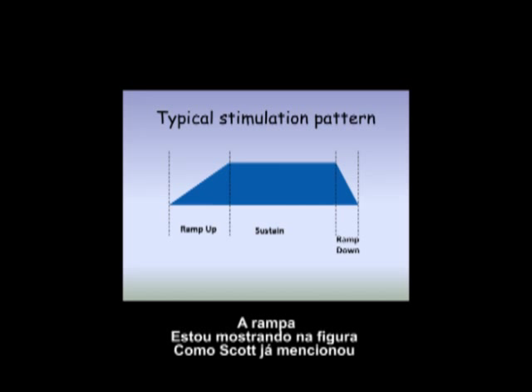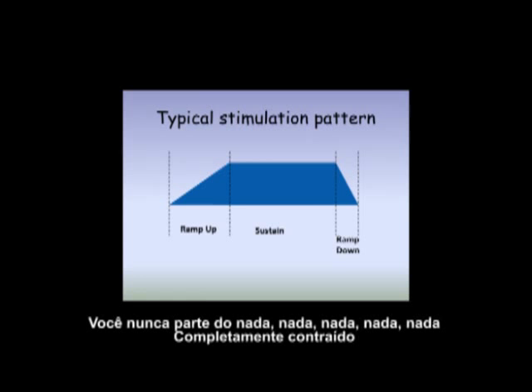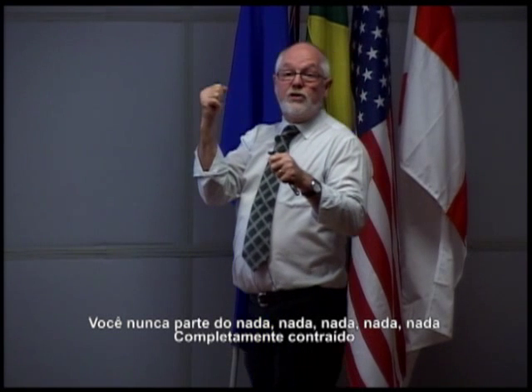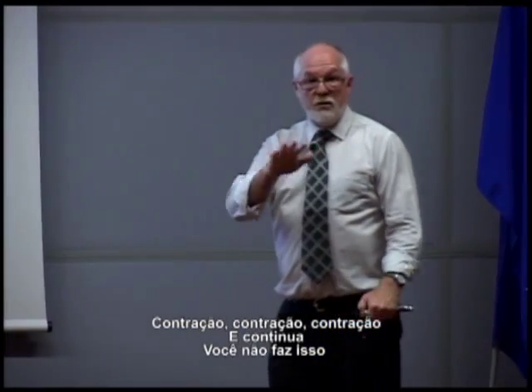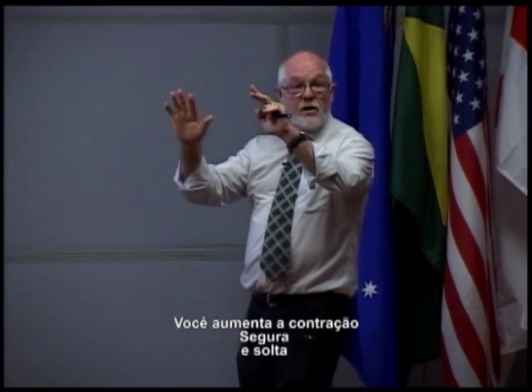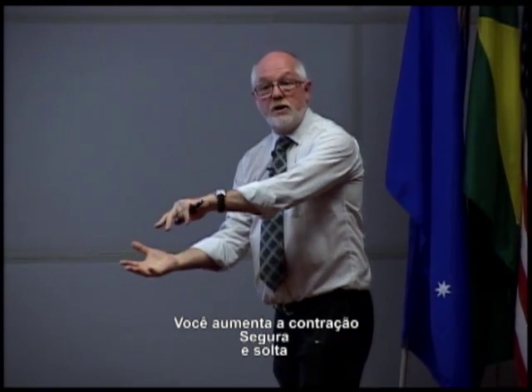The ramp, I've shown it on the picture. Scott mentioned it in passing. The ramp is where you gradually increase the stimulation. When you make your muscle work, you never go from nothing, nothing, nothing, fully contracted, and then let go. You don't do that. You build the contraction up, you hold the contraction, and you let the contraction go.